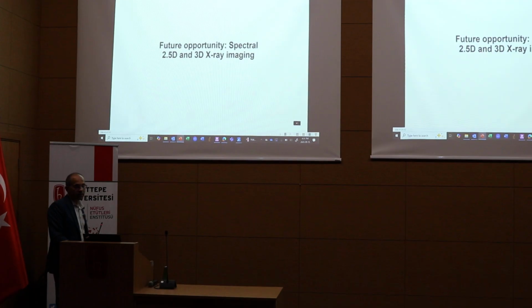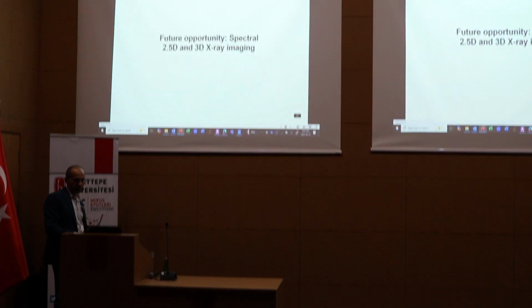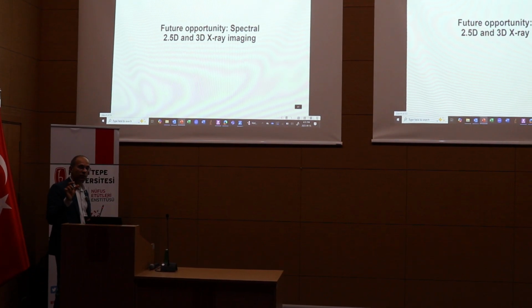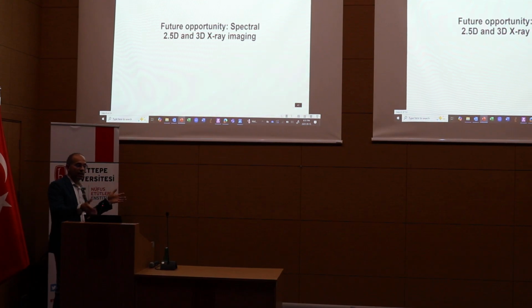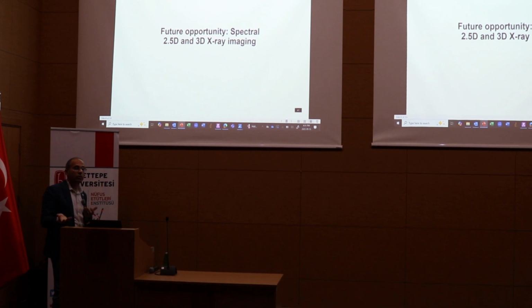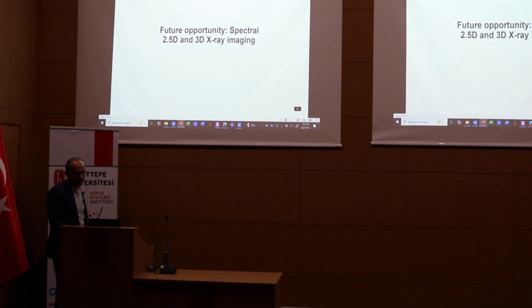And then going forward, everything I've shown you is two-dimensional, but there's no reason why this type of technology cannot be applied to 3D. Again, for portability. You can make very lightweight portable 3D systems that could do head scanning for like stroke patient detection. And there are other applications in here as well.